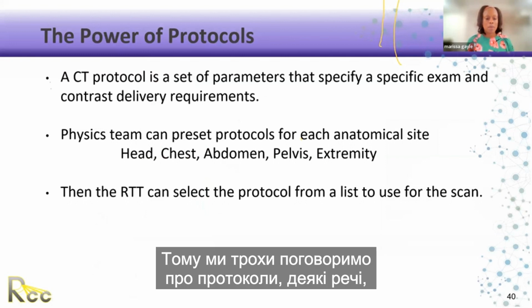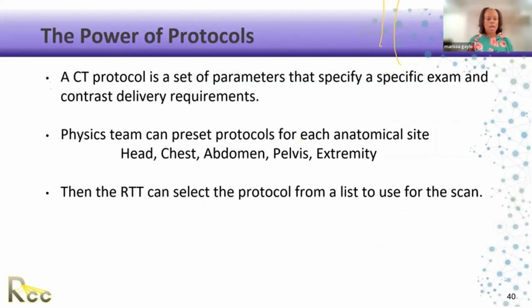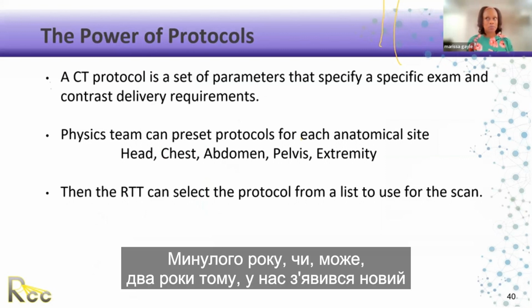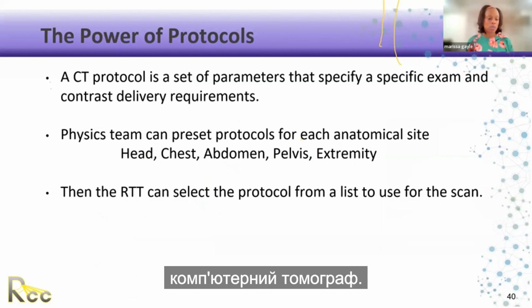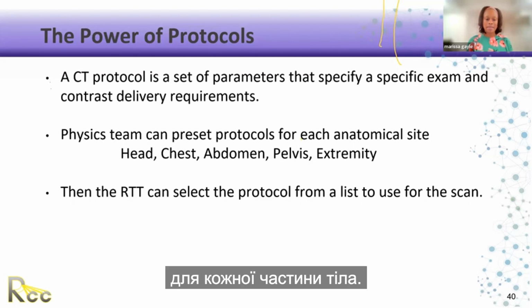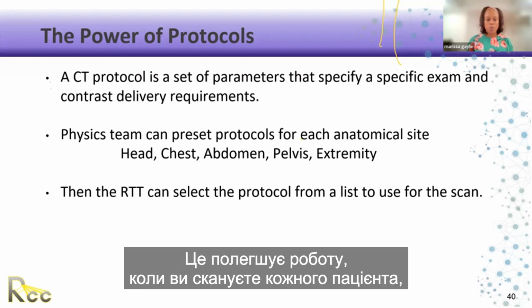So we're going to talk a little bit about protocols, some things to make our job a little bit easier. And I saw this firsthand. Last year, or maybe two years ago, we got a new CT simulator. And it was very interesting for me to see how we then created new protocols for every part of the body. So that makes it easier that when you scan each patient, you're not having to try and figure it out every single day.